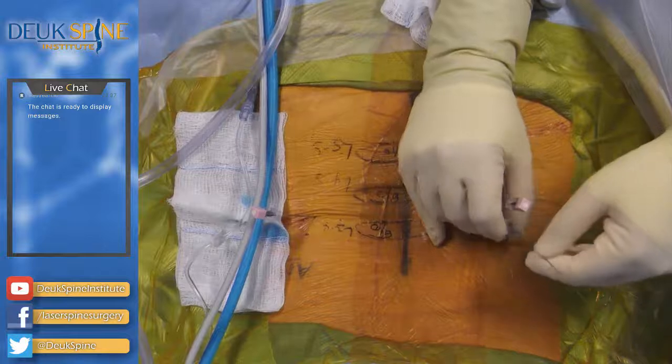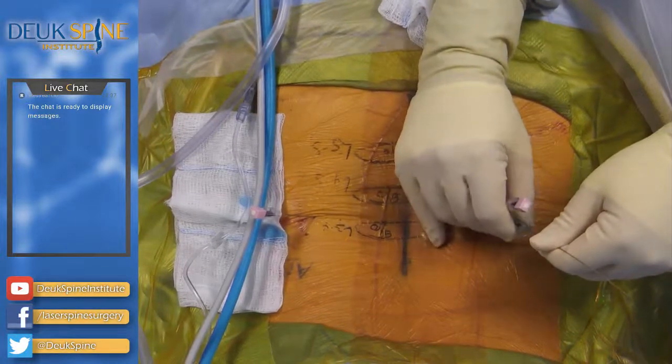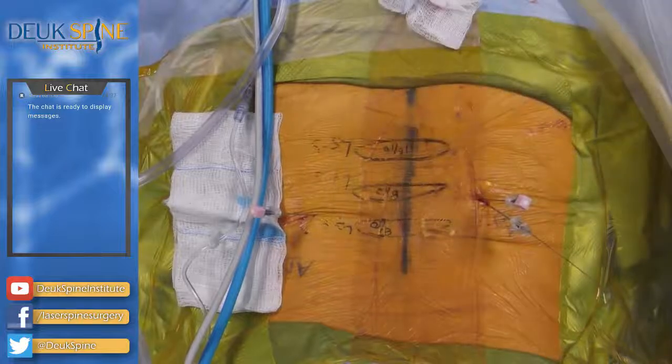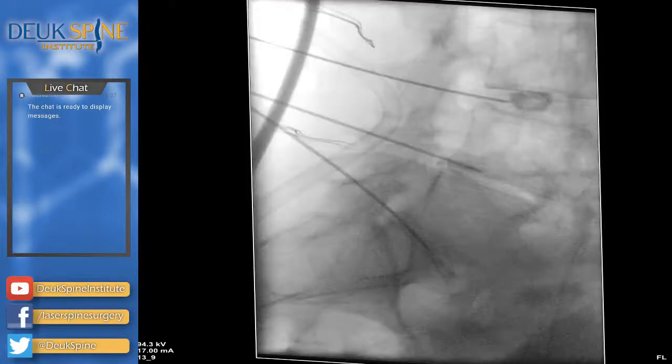All right. Here we go. We're going to take this needle out and leave the guide wire. Are you awake? So I'm going to need some help getting in. I need the lights down. This one on, so I can see. That's good. Oh no, that's bad. Yes, yes, yes. Thank you.